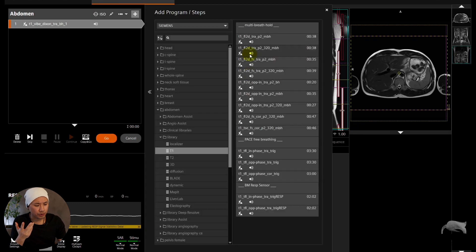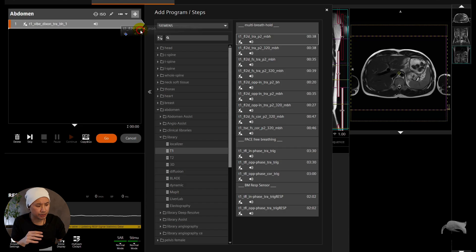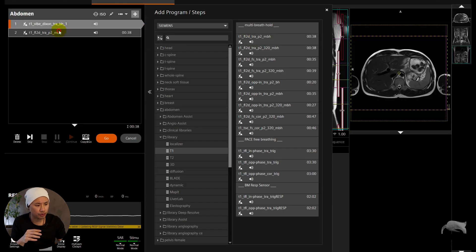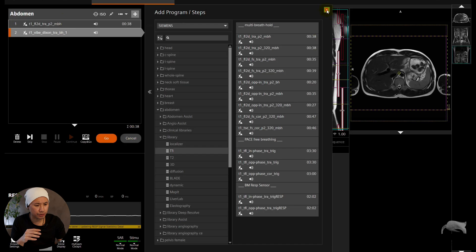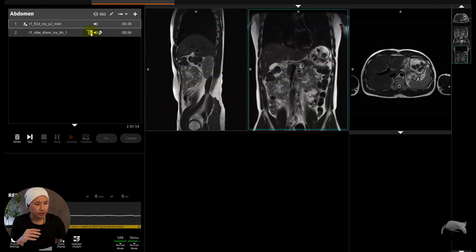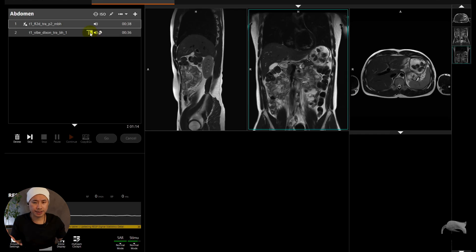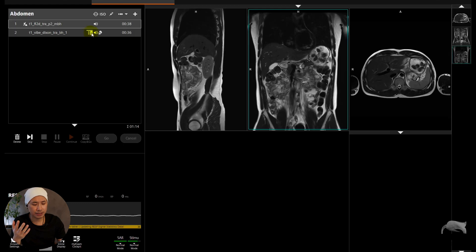So we can push Go now, but I'm just going to drag over another sequence to make everything stop so I can apply for you to show. Just push like this, Go, and then we are finished with the T1 VIBE Dixon. Let's say we're going to have a T2 HASTE. So a HASTE, we can do it very fast like I'm going to show you now.